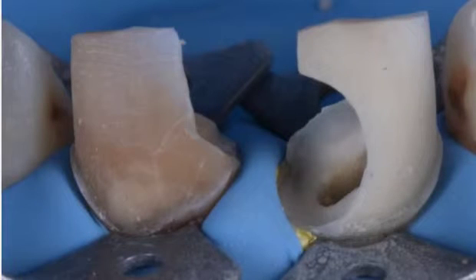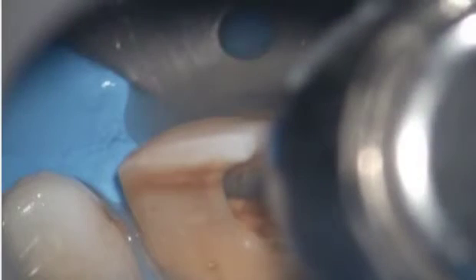Okay, how it was. Now the margin is perfect. I can observe it 100% and be safe during the irrigation procedures. Now the endo part, nothing special for endodontists. To remove the old obturation materials using the ultrasonic. Maybe some tricks with an assistant. I asked my assistant to rinse during the ultrasonic tips usage to be more efficient and to have a cleaner surface.